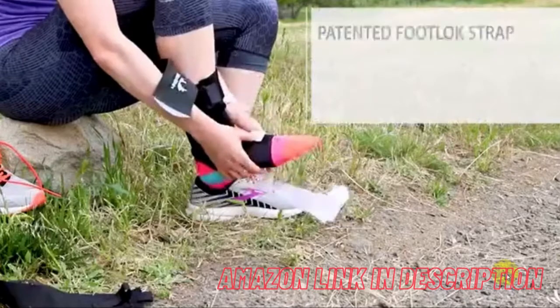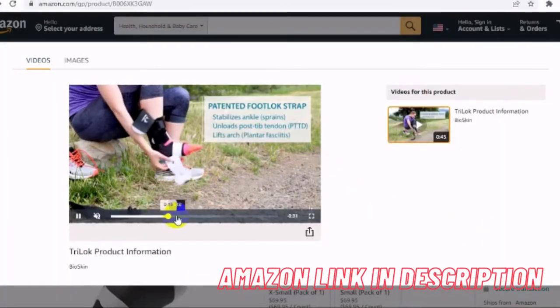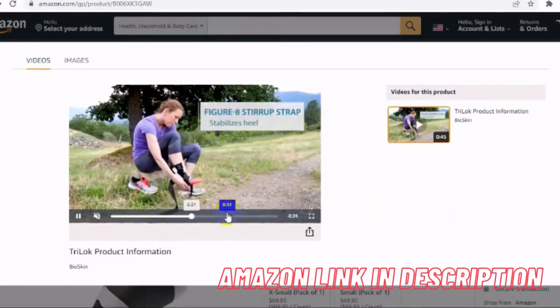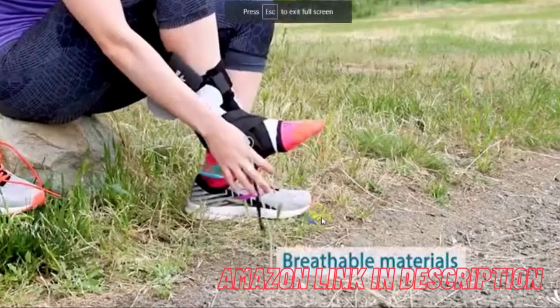Premium comfort: the Tri-Lock is made from soft hypoallergenic materials that are breathable and low profile, rather than bulky suffocating canvas braces. The Tri-Lock allows for active mobility but restricts harmful movements, making it perfect for sports and regaining mobility.